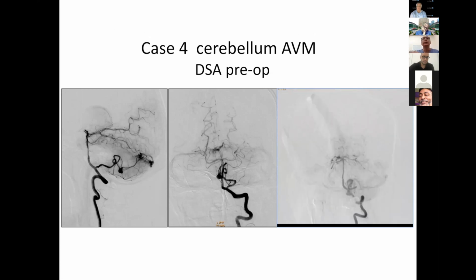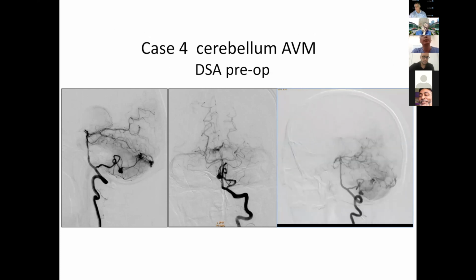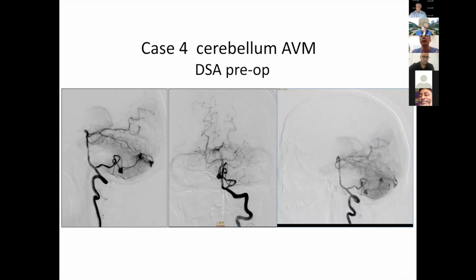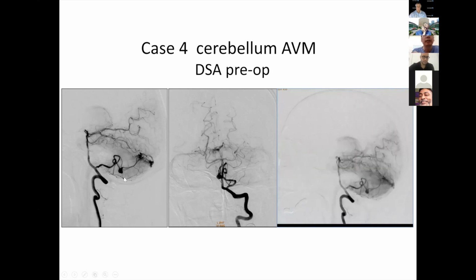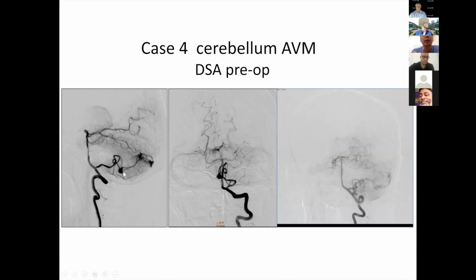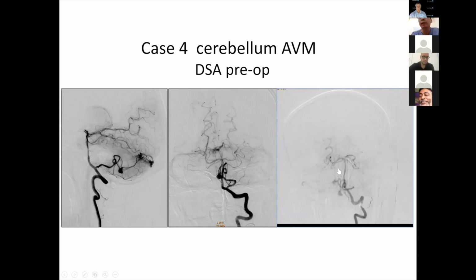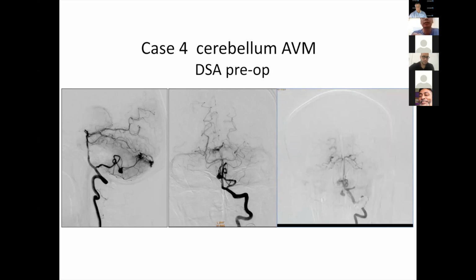So besides supratentorial AVM, I perform some AVM located in the infratentorial region. This is the ruptured one. The AVM is a very small size. And this is a ruptured aneurysm, a flow-related aneurysm that ruptured. A rotation angiogram shows the relationship of the aneurysm and the nidus.